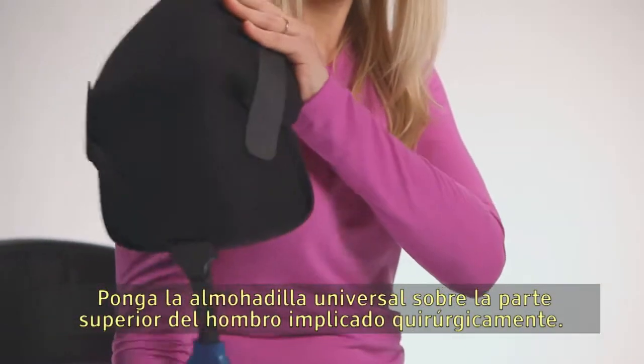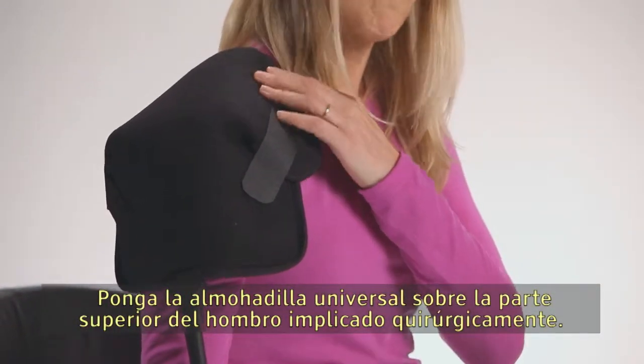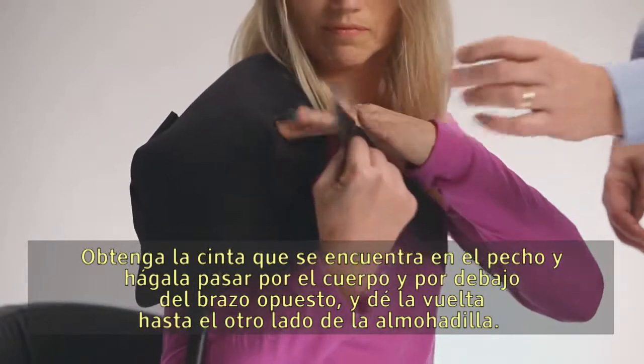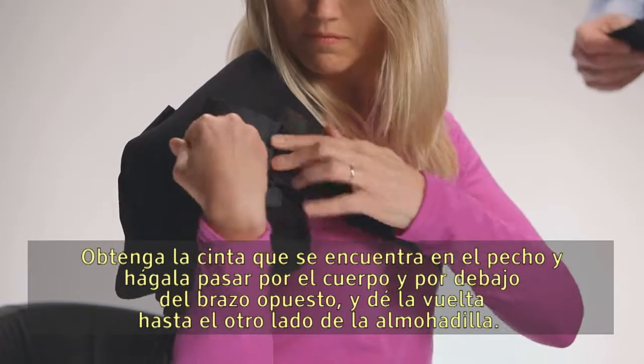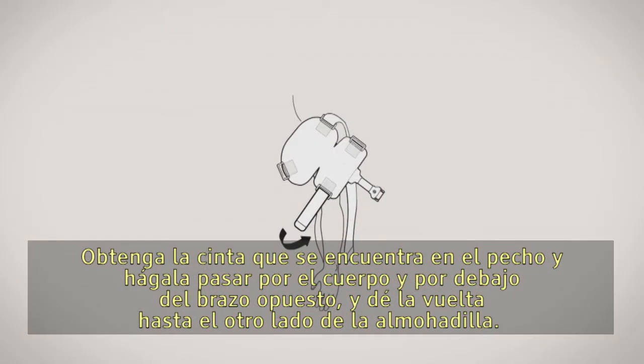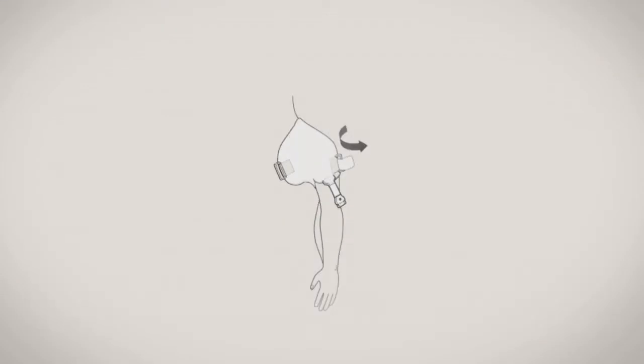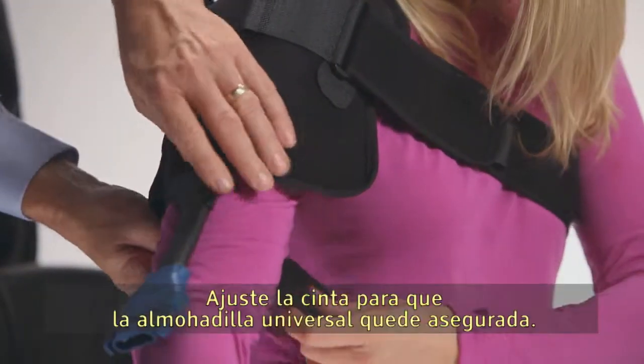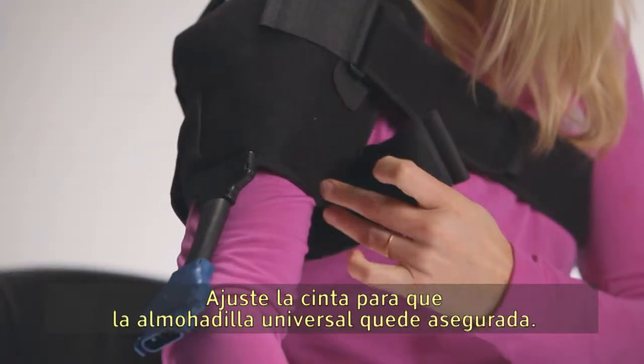Lay the universal pad over the top of the involved surgical shoulder. Take the strap located at the chest and run the strap across the body and under the opposite arm, then back around to the other side of the pad. Secure the strap around the arm and tighten the strap so the universal pad is secure.